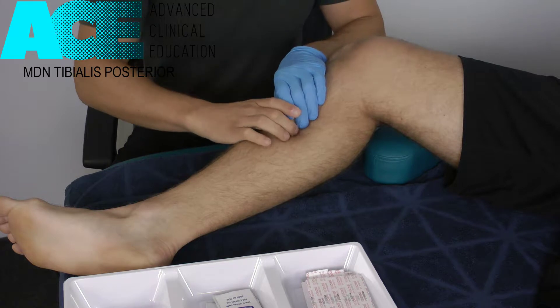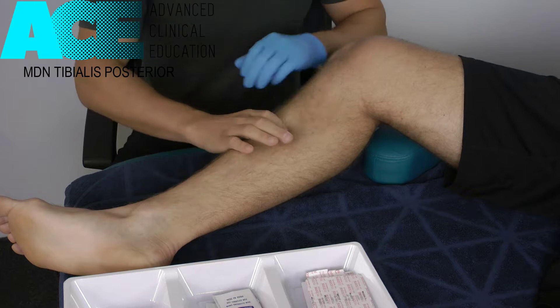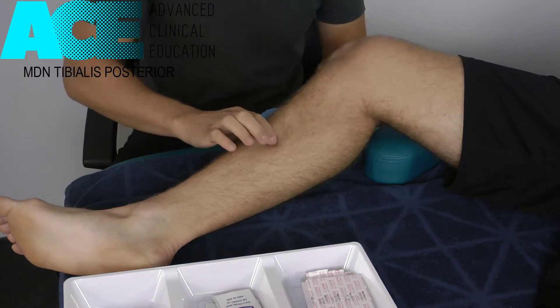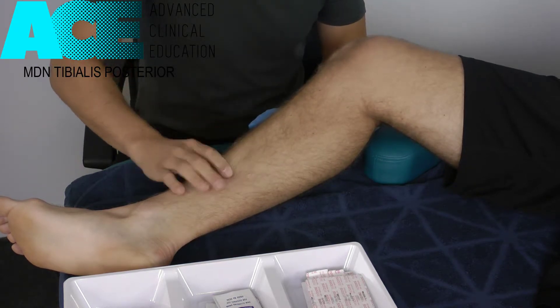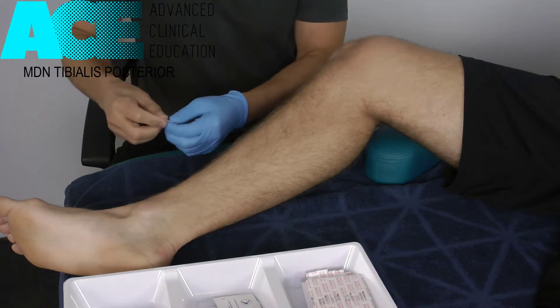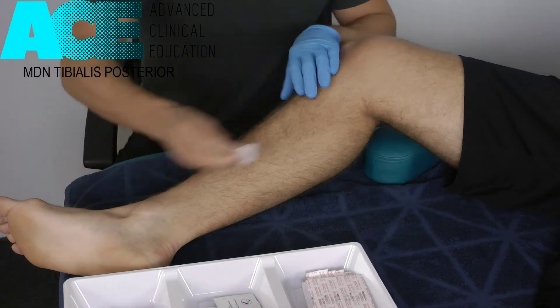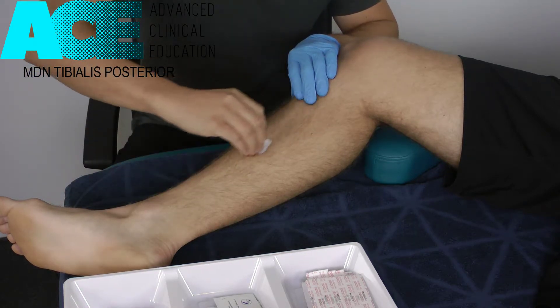This puts a lot of stress and strain through tibialis posterior, and we end up developing a lot of tension and trigger points through this muscle. A great way to access those trigger points — given that some of them hide behind the tibia — is with dry needling. What we're going to show you now is just a really basic dry needling approach to access some of those trigger points.